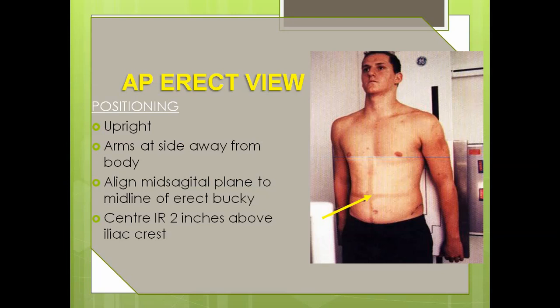So erect view will usually be taken to see the air or fluid level. When the patient is standing, what will happen? The air will come up and stay under the dome of the diaphragm. If that is not included, you have to repeat the radiography.